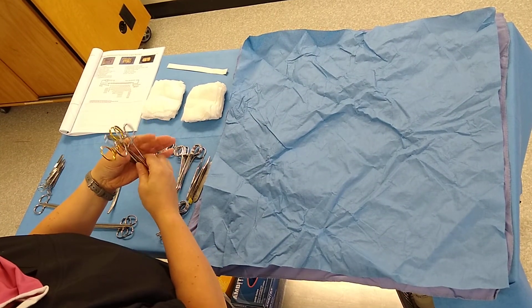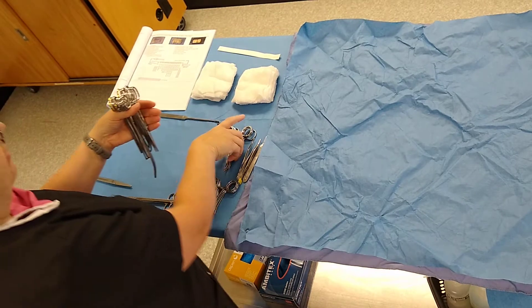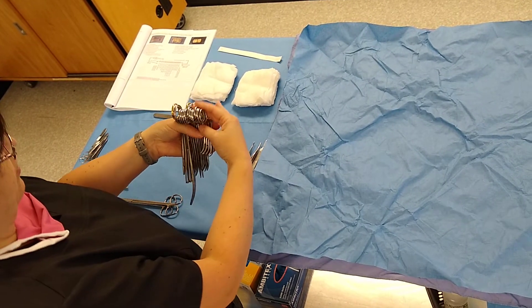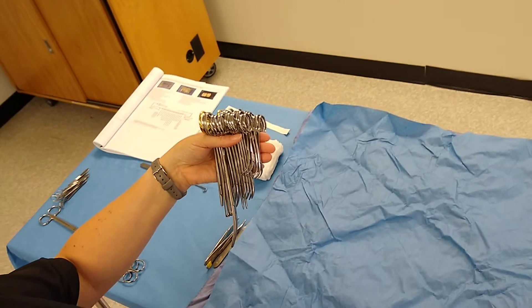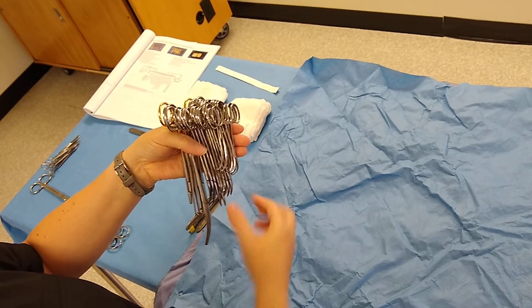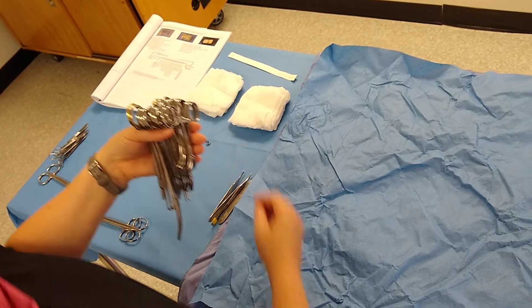Line them up in a row. I'm not going to go over each individual instrument at this point because there's another PowerPoint that covers those. When you place instruments in your hand, you want to make sure you go tallest to shortest and curved to straight. These instruments lay nicely against each other. We're also lining them up for function.